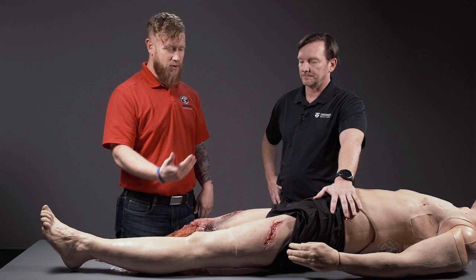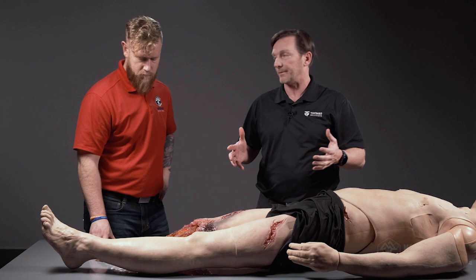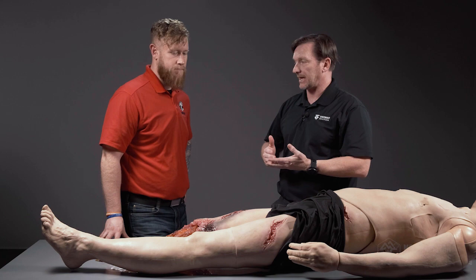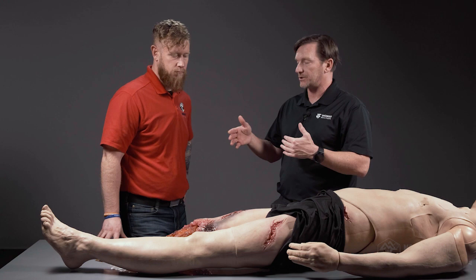Dennis is going to walk us through some of the more common injuries. Using the TacMed simulation lower for this demonstration, we're talking about extremity trauma in general. Extremities are fairly straightforward because the fix for extremity trauma is tourniquets. In the initial phase of care, we place them high and tight because we don't know where the vessel is injured.